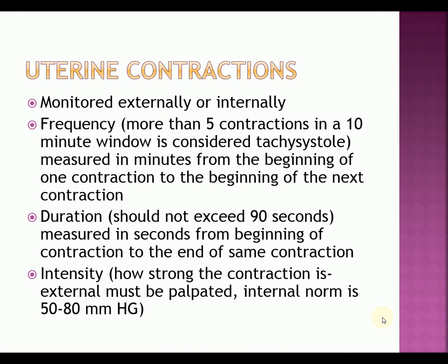However, the majority of us will be using palpation to see how strong the contraction is. And the rule of thumb is that, especially if you've never done it before, you want to lay your hand very lightly on top of it, or your fingertips on top of the fundal height, and see how strong the contraction is. And you have to leave your hand there long enough for the contraction to occur and then to be able to feel it during the duration. So how strong is it by feeling palpation?